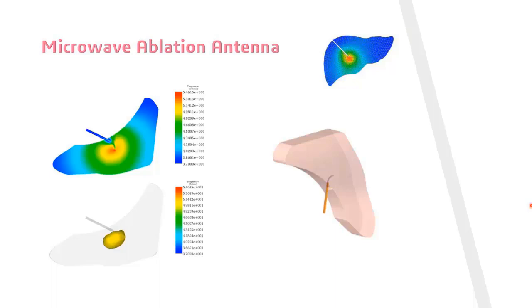As shown in this case, we study an RF microwave ablation case based on thermal therapies, which is an attractive solution for large tissues within a short treatment period. It's suitable for destroying tumors in different biological tissues. The antenna probe produces rapid heat generation to locally heat the tissue.